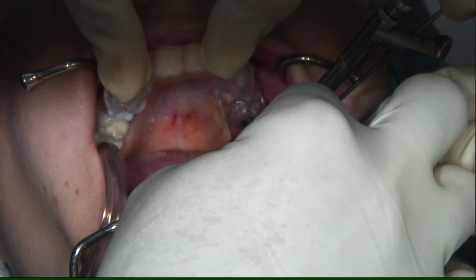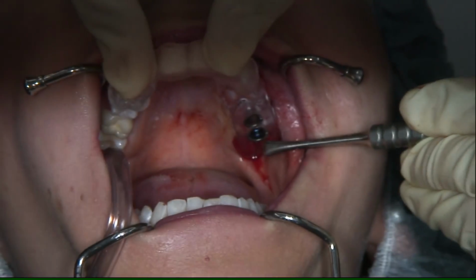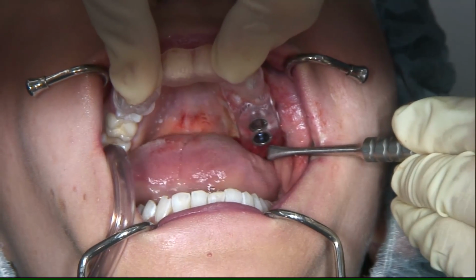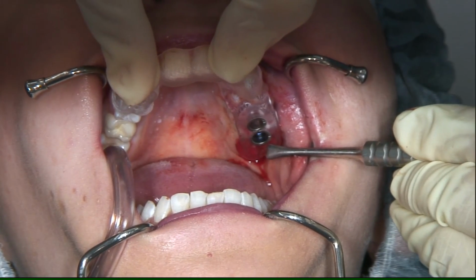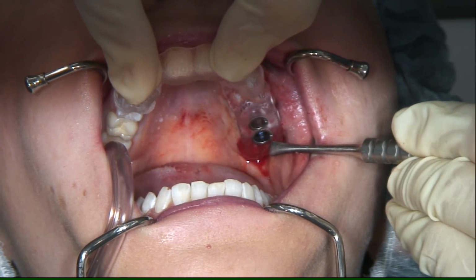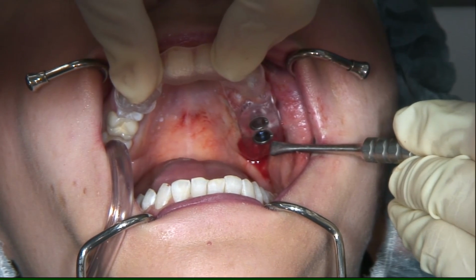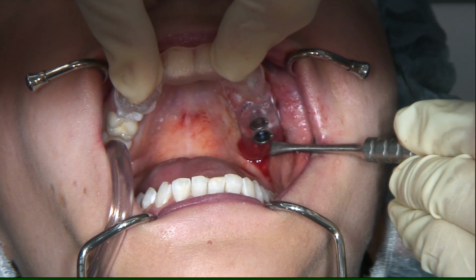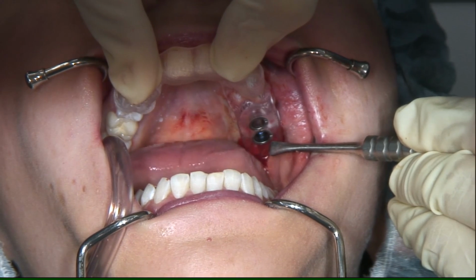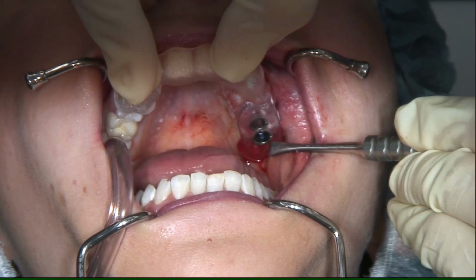And you see small dots at the implant driver. Six dots are milled in a circle on the Xive implant driver for implants, and each dot indicates the center of a face of the internal hexagon. And at the end, one dot on the implant driver must point in the vestibular direction in the end position. Okay, we have the final position now of the first implant.